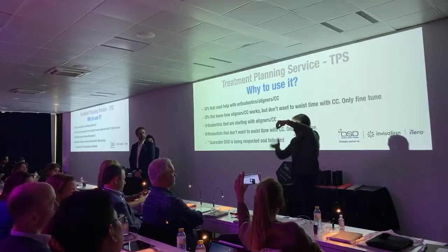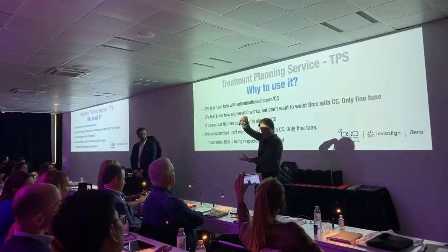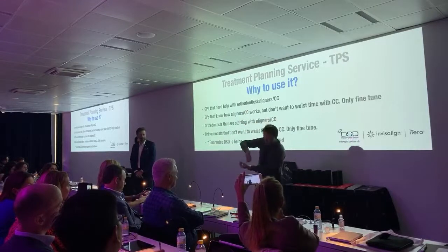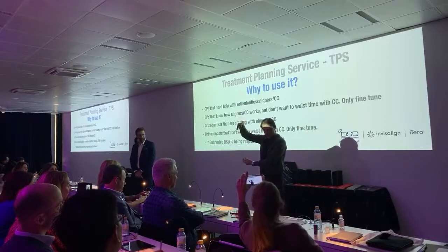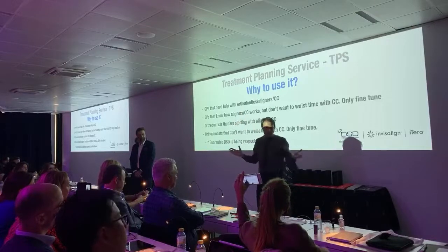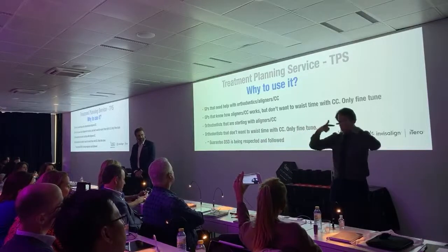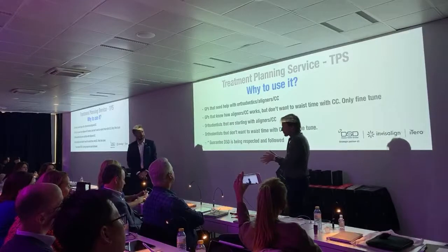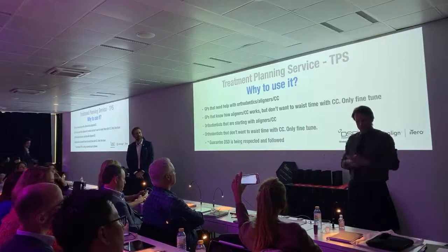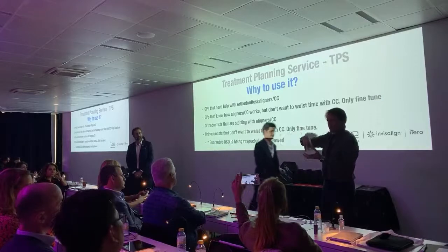Okay? When you sell the case and you start the treatment, the process inverts. Because now you need to actually order the Invisalign. Right? So now your orthodontist is on top of that process, and you're just a team player there, right? And he needs to then order the Invisalign case like you always did. If you did a DSD work on the same patient, and then you order DSD Invisalign, your orthodontist will benefit from the fact that his ClinCheck has DSD in it. That's it. And if your orthodontist needs help, he hits TPS, and we jump in.